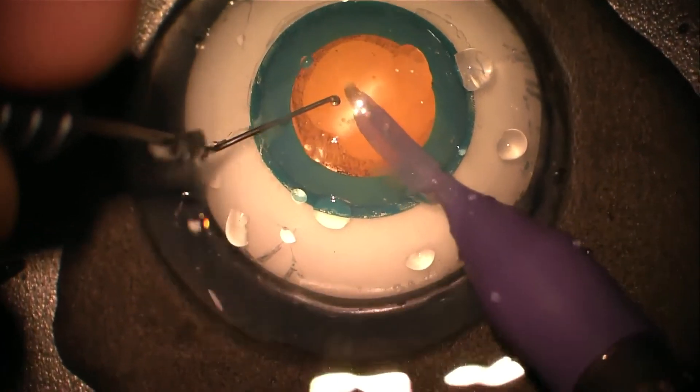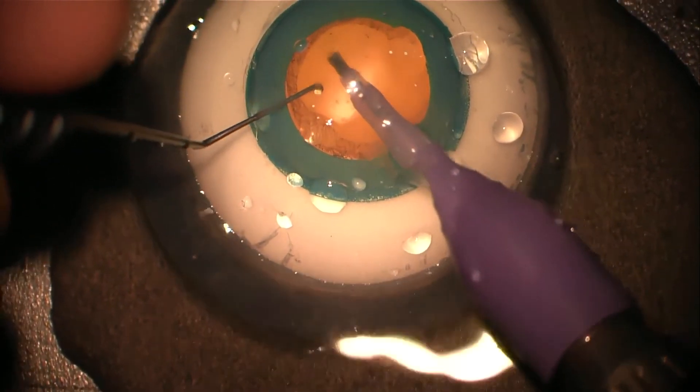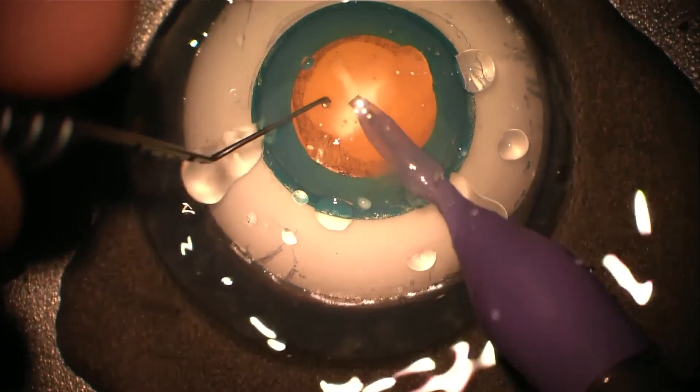And finally just completing the fourth groove, again avoiding the anterior edge of the rhexis before dividing the nucleus into quadrants.